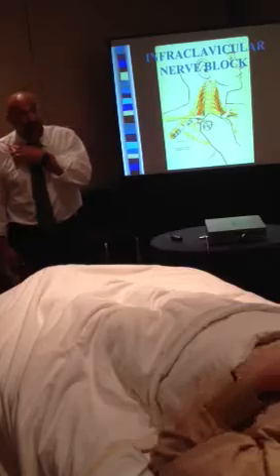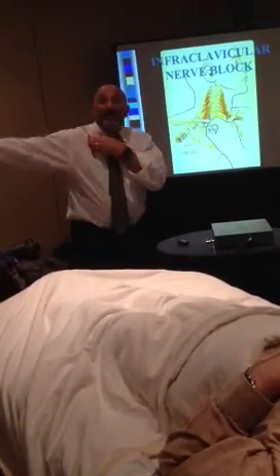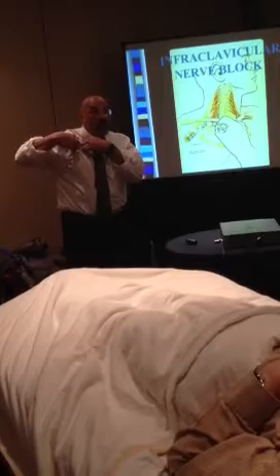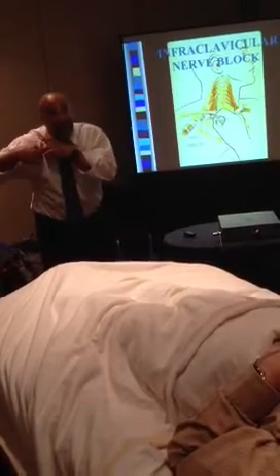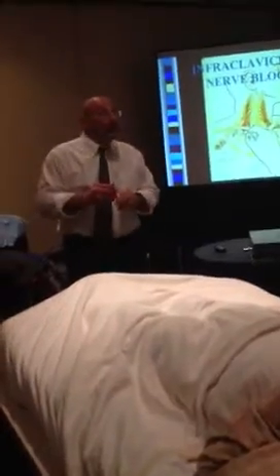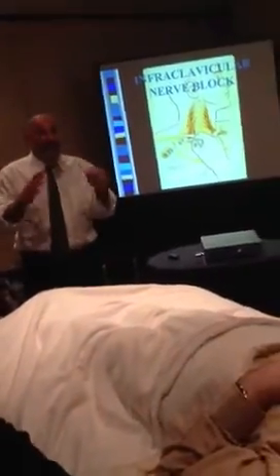And if I make mistakes 1 and 2 at the same time, meaning my arm is at my side, I draw a line along the plane of the patient, and abduct the arm to do the block, you see where I found my insertion site is over here. Where I want it to be, it's over here. I'm way too medial. So my insertion site is, and I will repeat this no less than 112 times in the next 10 minutes, I promise you.